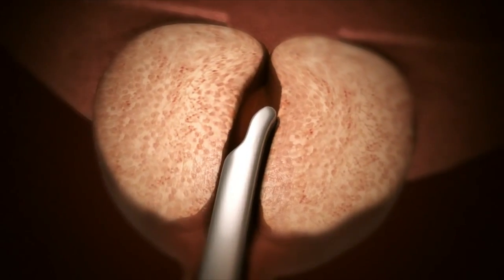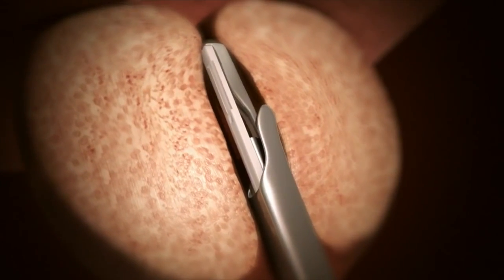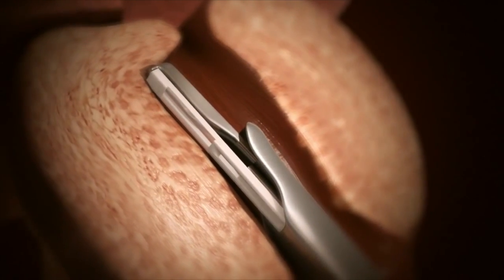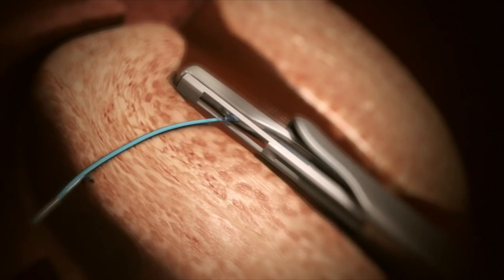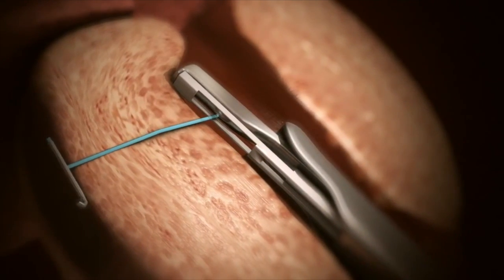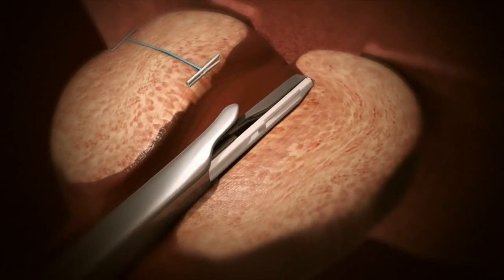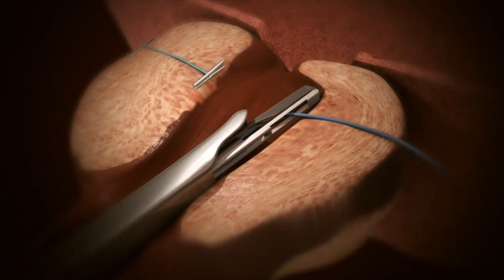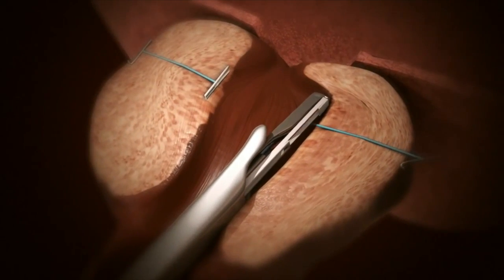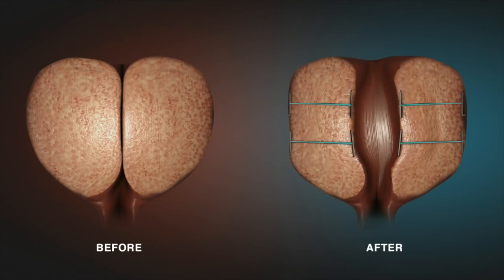Urolift, again, is a procedure we do in the office, and we go in with a scope. We've numbed the prostate using some lidocaine. There's no IV involved, although we sometimes do offer patients sedation with Urolift. Through the scope we're able to deploy these sutures. They're surgical sutures really that function as anchors, and they pull the prostate apart, and this opens up the passageway. It opens up the donut hole and allows urine to flow better, and patients' symptoms are improved.